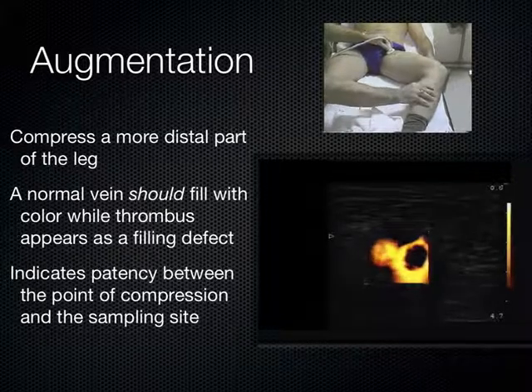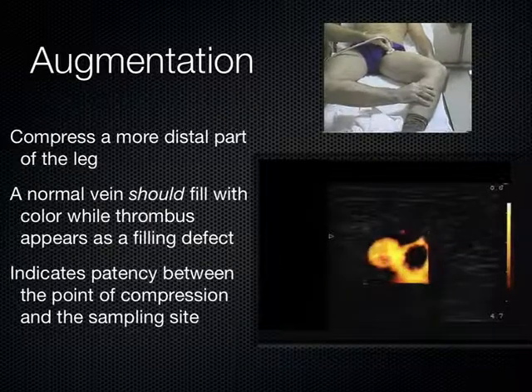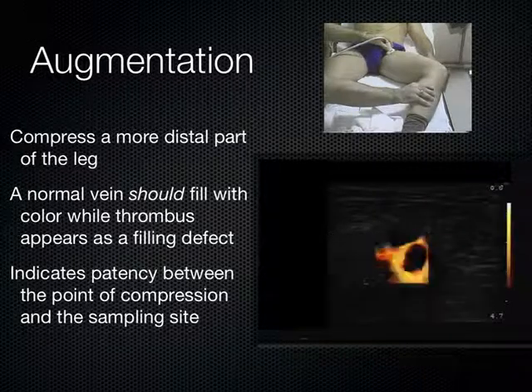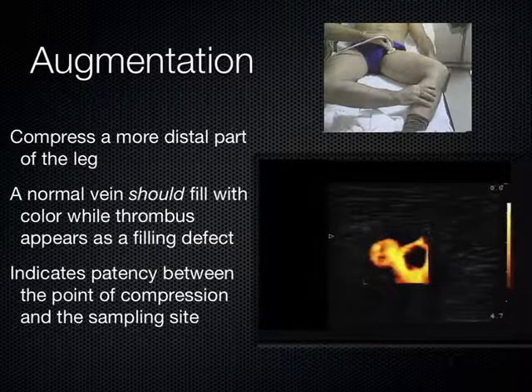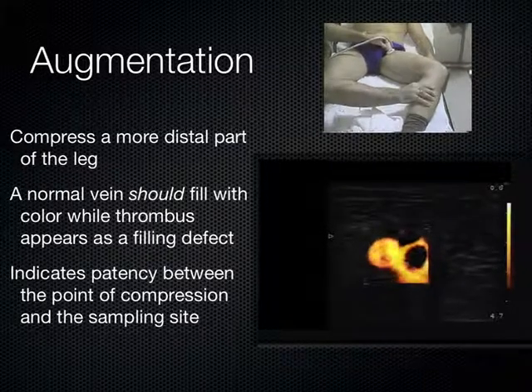One final word before I conclude is that you may not be aware that after hours and on weekends around the country, in about 85 to 90% of hospitals, it's actually not possible to get your patient a DVT study, because there's no staffing, there's no ability to do it. And so what do you do in that situation? You have a patient that you think could have a blood clot in their leg, you can't get the study done.